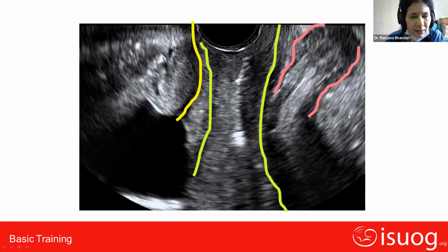The screen is the picture of the patient. It is opposite to the one who is sitting in front. That you have to remember, the screen is a picture of the patient, how she is lying, and it is opposite to us. So all the anterior structures are towards the right side, the posterior structures towards the left side.